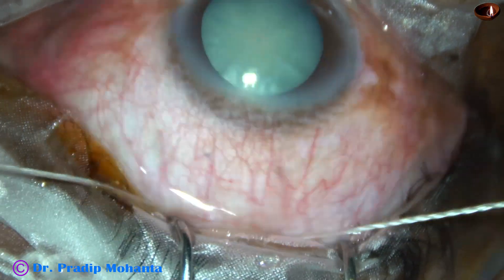Hydrodissection is being done. The nucleus has come out. I inject viscoelastic both in front and behind the nucleus — behind this lens mass — and take the irrigating vectis. I like this instrument very much.